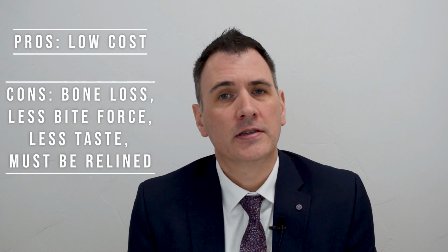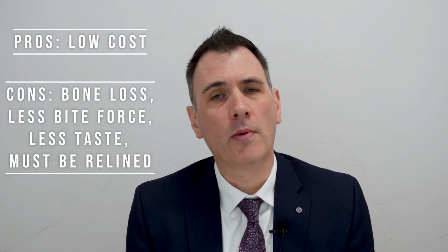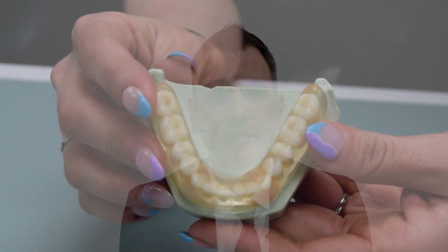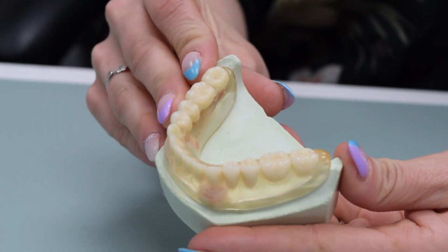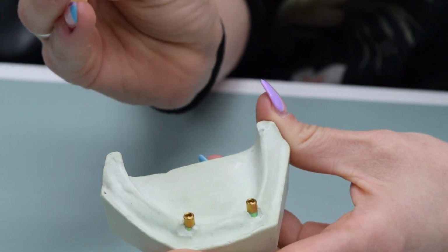It's just something that gets you a smile. But we want more than just a smile. We want to get function, which is why we have other options available. The next option from a denture is to go to a snap-on denture. Like the name implies, it's still a denture, but it now has the ability to snap onto something to help keep it in place.